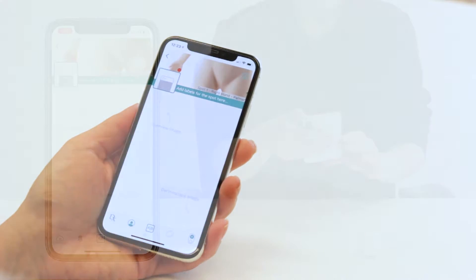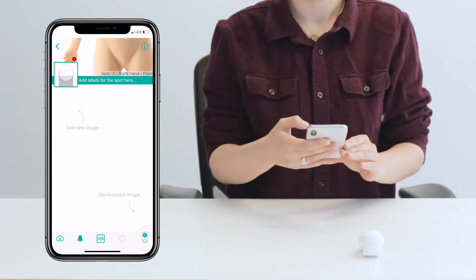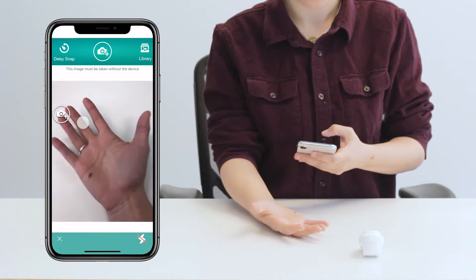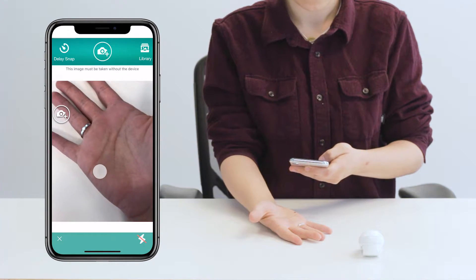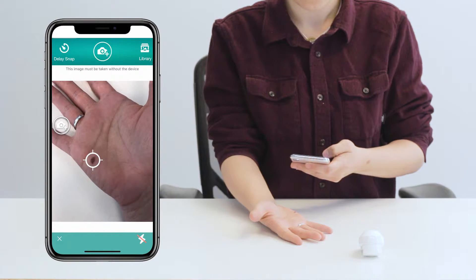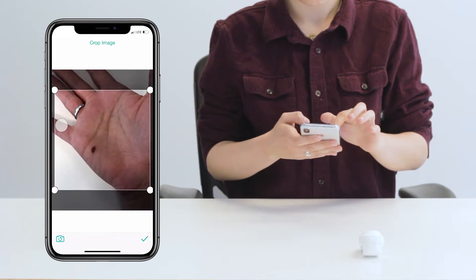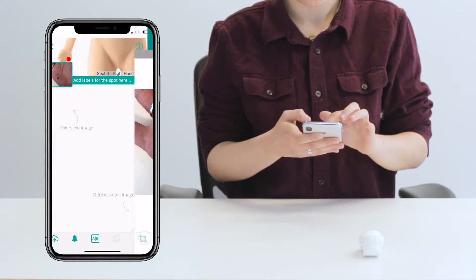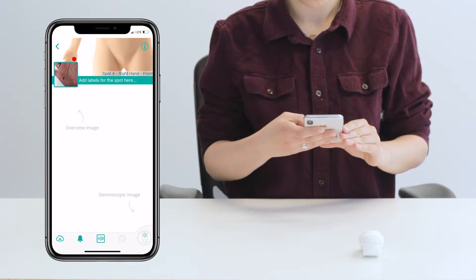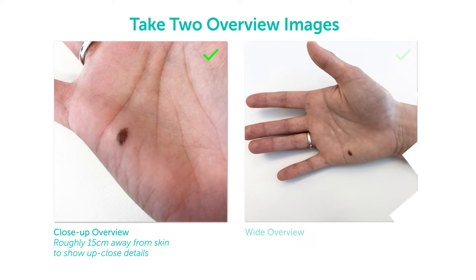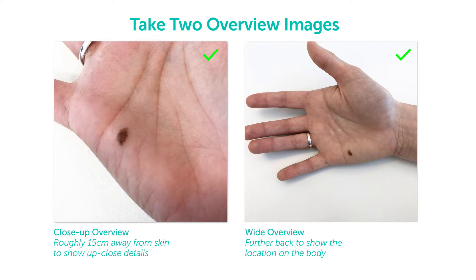Let's start by adding the overview image. Make sure you're in a well-lit area. Select the overview icon and position yourself to take the image. Tap the screen to help focus the camera. When ready, take the image by pressing the camera icon. You have the option to crop your image as well. Once you're happy with the image, tap the check mark to save. We recommend taking two overview images: one close-up overview image that is 15 centimeters away from the skin, and one further back to make visible where the lesion is on the body.